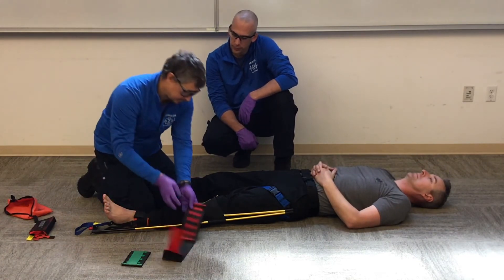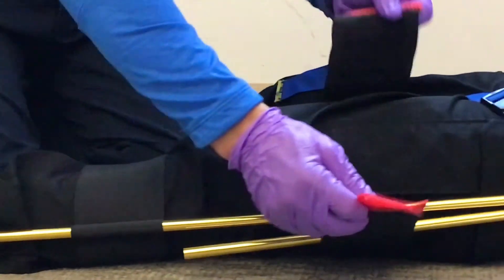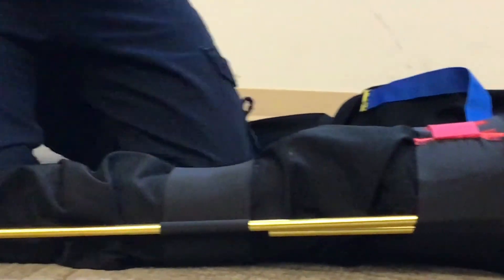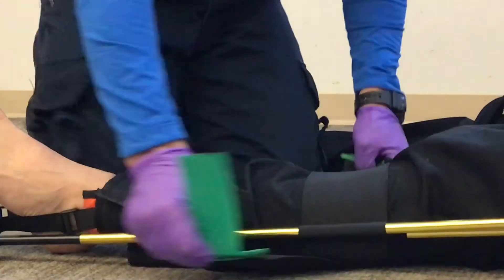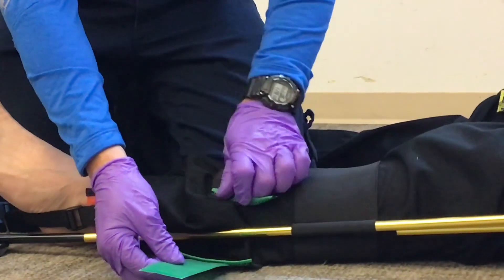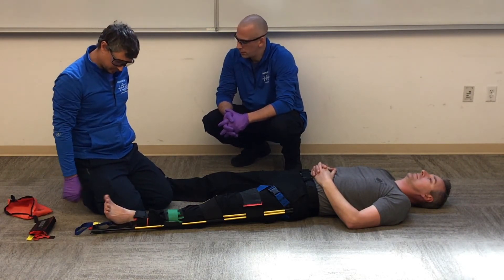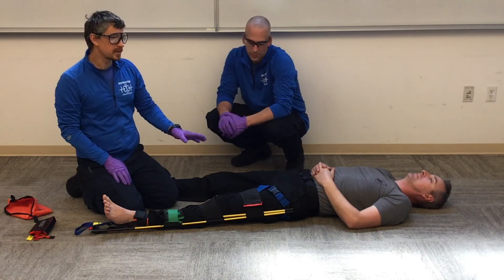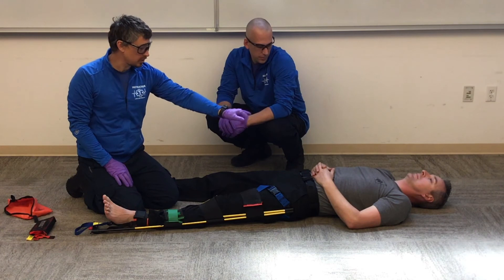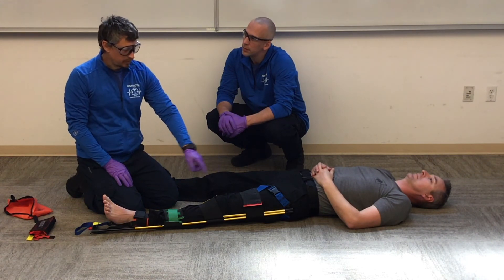I'll go ahead and secure my device — slide this under the gap in the knee, up over the thigh, slide this under the knee and floss it down over the calf. Then I recheck my CMS: equal bilateral pulses. Can you wiggle your toes? Can you tell which toe I'm touching? Big toe. Little toe. Now we're going to move our patient to the backboard, secure the torso, hips, and device to the backboard, and recheck CMS. That's our traction splint of a femur fracture with a KTD.